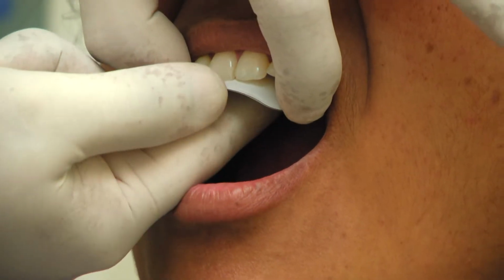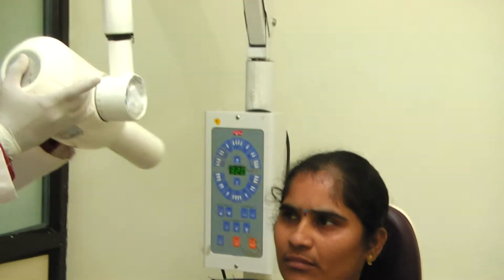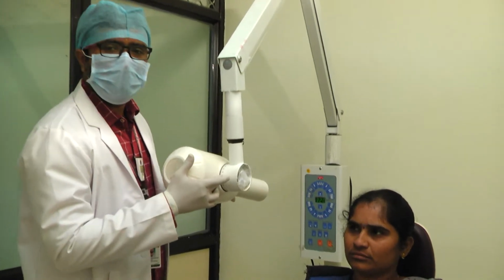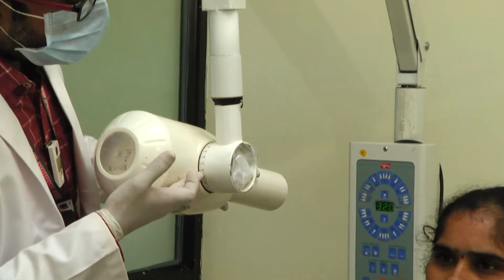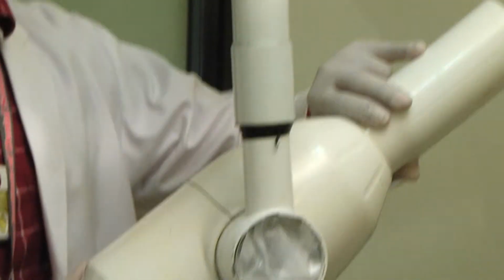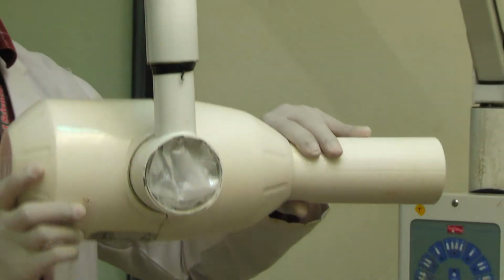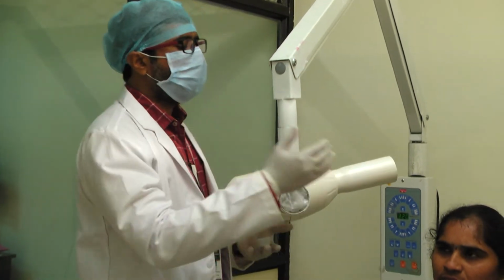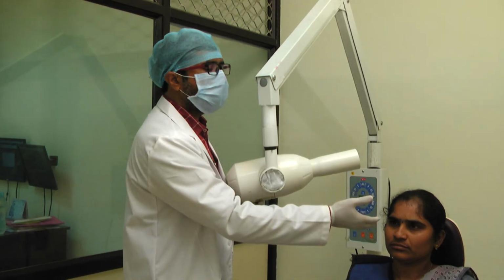Once the placement of the film is done, ask the patient to tilt the head slightly down, that is, make the occlusal plane horizontal. Then on the X-ray tube, as I described, we have different angulations which are already prefixed on the X-ray tube head. We have 0 followed by positive vertical angulation, and 0 followed by negative vertical angulation. Always for maxillary teeth it is positive, and for mandibular teeth it is negative vertical angulation. Now we are going to point out the projection for the maxillary incisor.